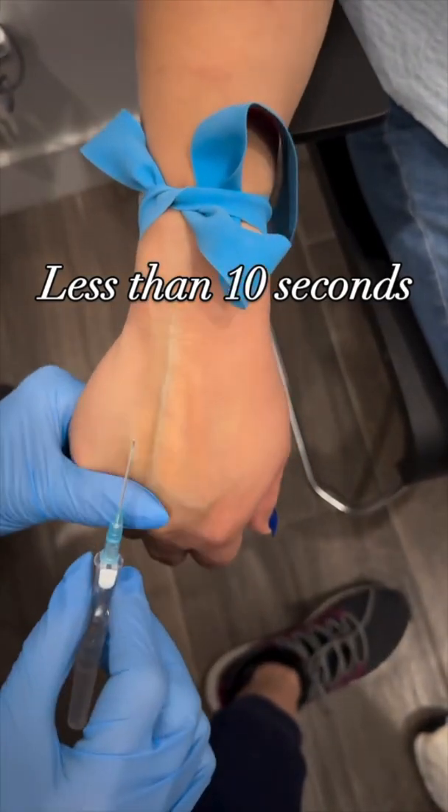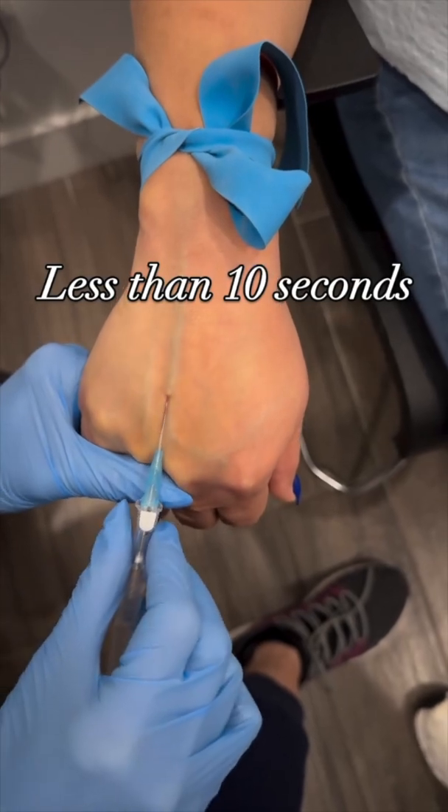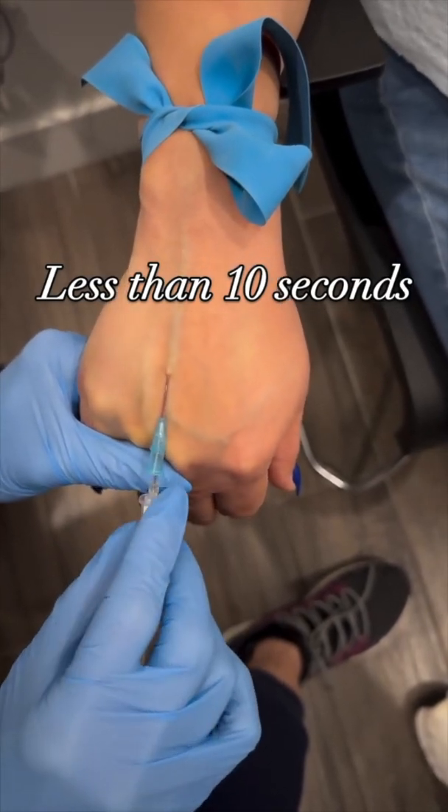That vein is straight as an arrow. This is just a gimme one here, but she's kind of hitting it at an angle. You should just be right on top of the vein, right in line with it.